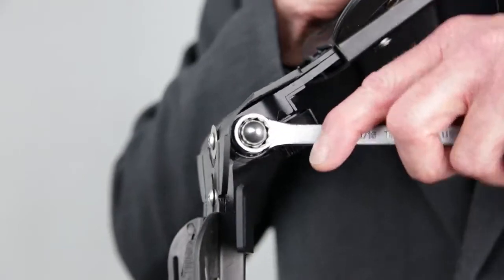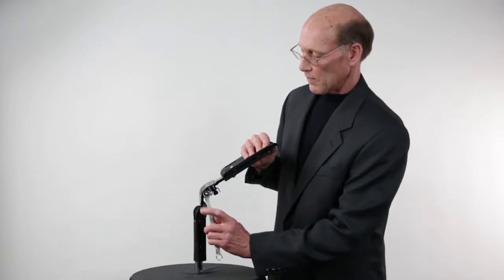This will lock the joint in the desired position, eliminating any flexion or extension motion beyond the set position. To return the device back to the free motion position, reverse the procedure.